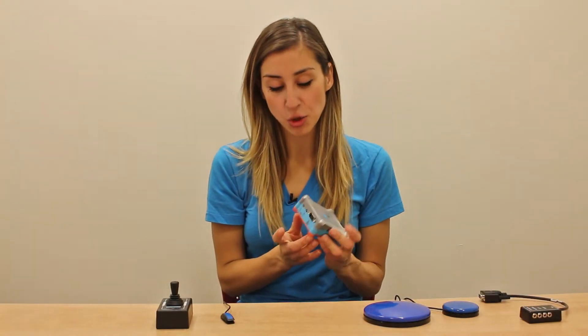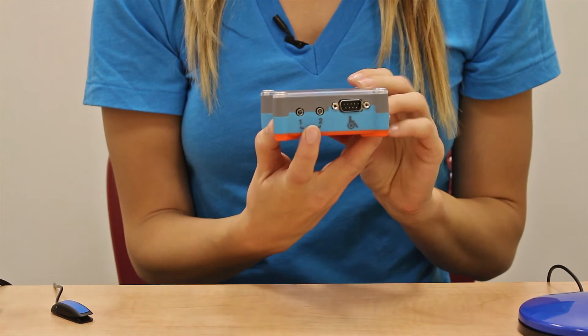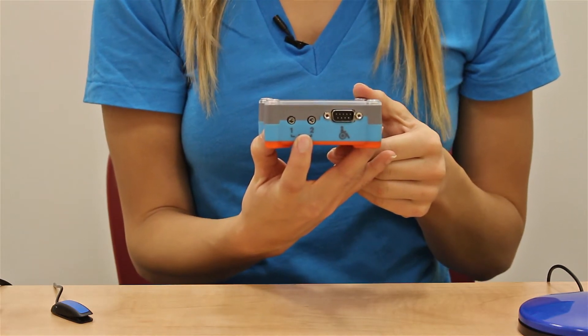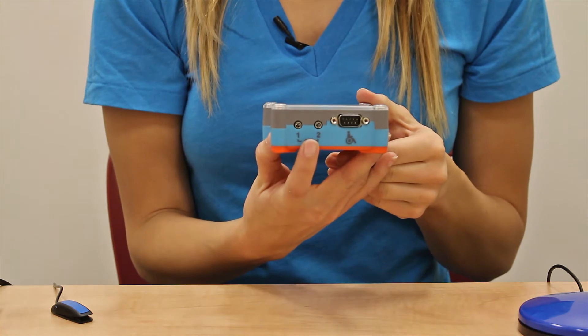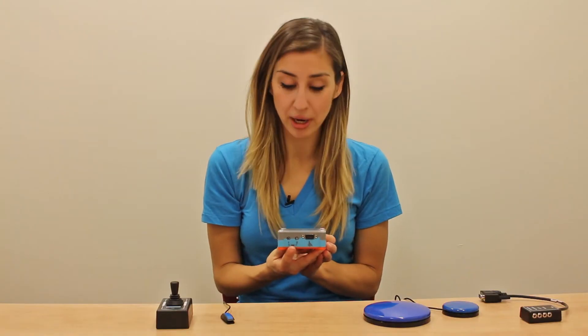On one side of the Tecla, you can plug in your assistive devices. Here are two ports where you can plug in just about any standard accessibility switch. These could be simple buttons, light touch switches, switches activated by blowing or blinking — just about any switch you can think of.